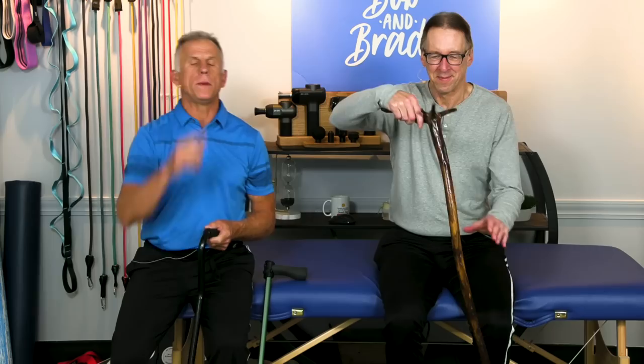Using a cane can keep you walking further, faster, and with less pain. Everything you need to know about how to use a cane, adjust it, and be safe with it up and down stairs, we'll cover in just a few seconds.